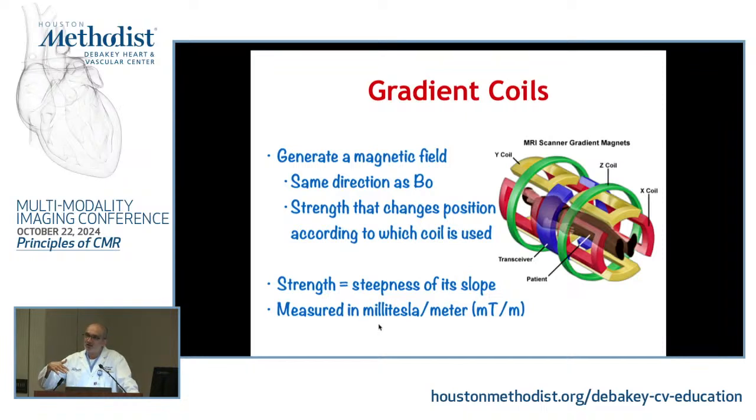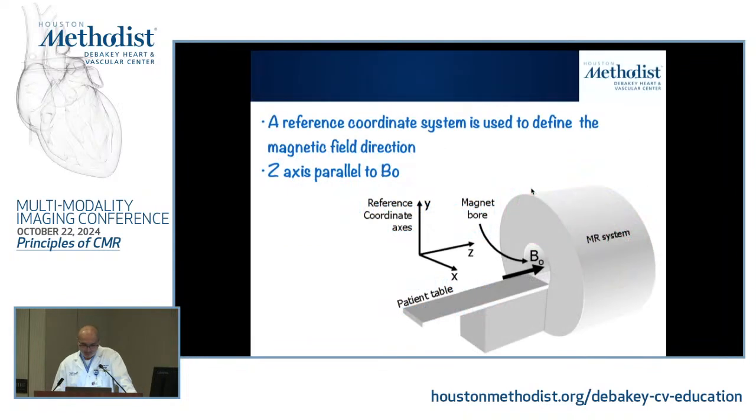Not only do you want to achieve an alteration in the local magnetization, but the quicker you can achieve that, the faster your imaging can be. Now, there's trade-offs, though, because obviously if you have a very steep gradient and you do it very fast, what's the risk? Well, the risk is you can get peripheral nerve stimulation, right? Again, at the edges, right? So furthest away, so towards the foot or towards the head. So, it's not one of those things where you just make it as high as physically possible. You have to balance all of these things.